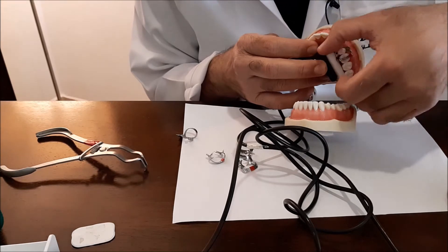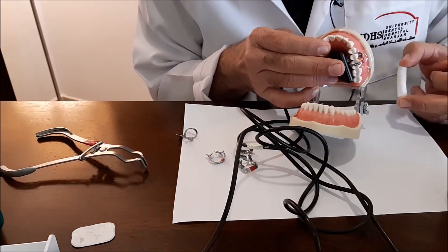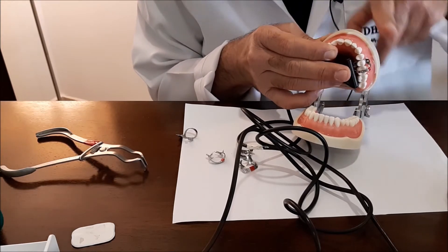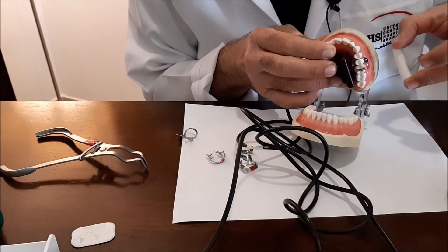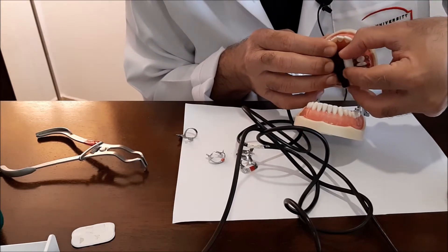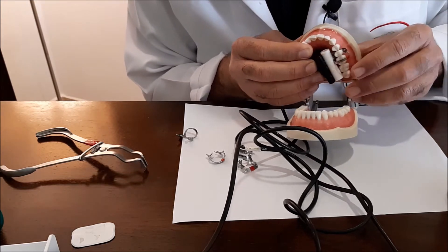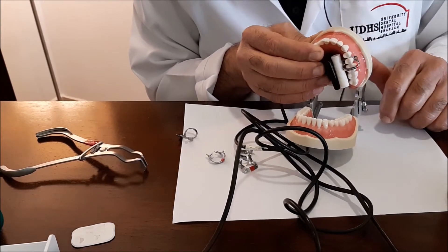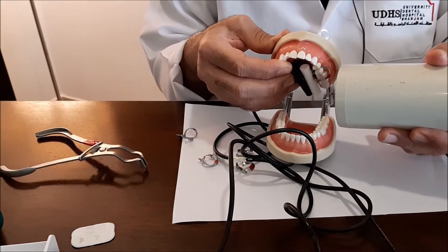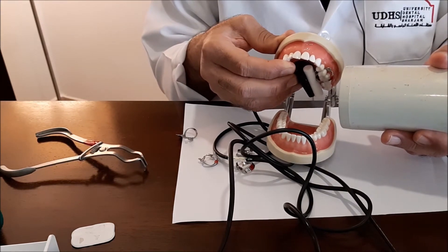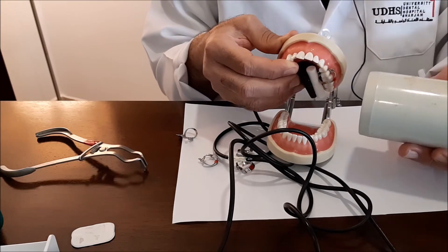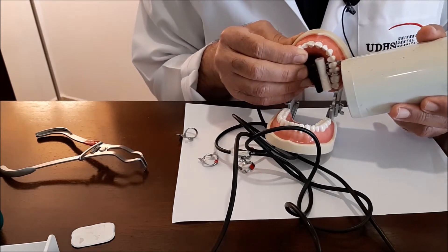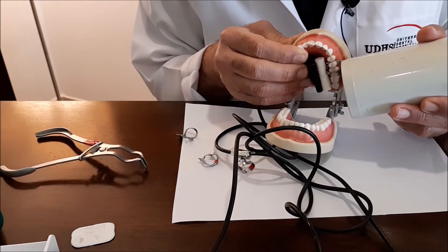Instead of inclining the sensor, giving it an angle between the tooth and the sensor, what I do is that I place a cotton roll here. See now the sensor is more parallel with the tooth. Instead of using the old technique, you will simply direct your beam at plus ten so that it will be perpendicular on both the tooth and the sensor. You will get a beautiful image here.